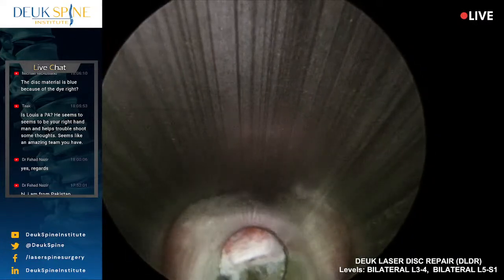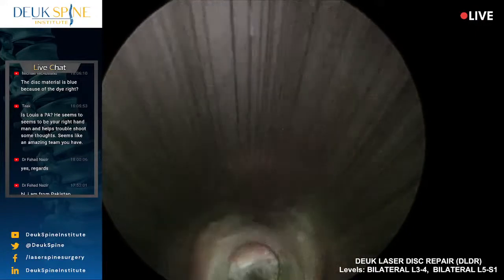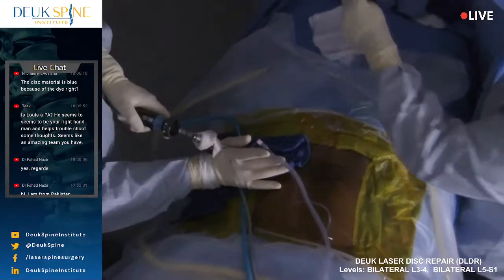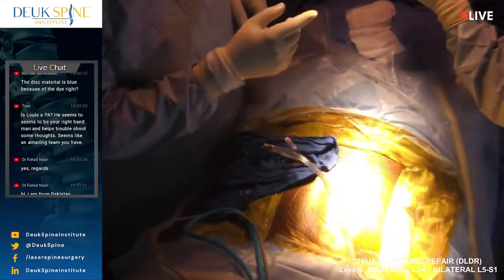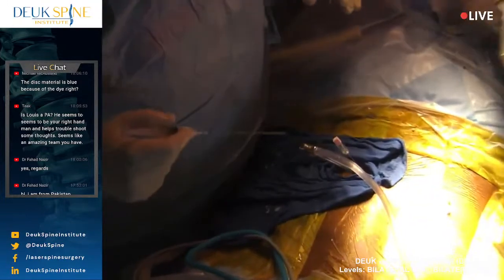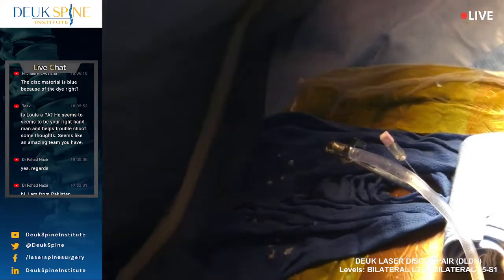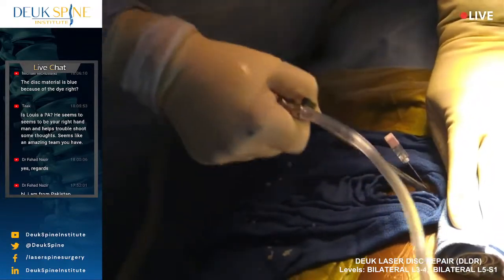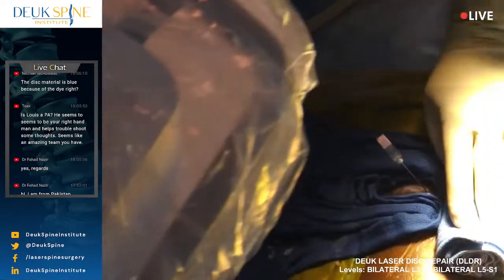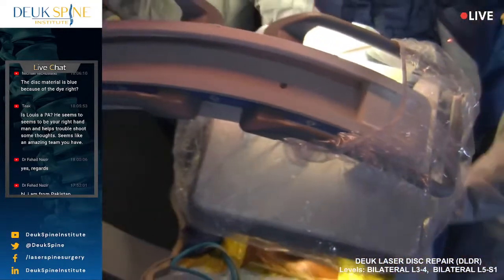Off. No, we're done. Stop, please. Light on. One more to go. Monica, come. You gonna put a stitch on the other side? Yes, sir. I got this. Why don't you do that? Lateral, please.